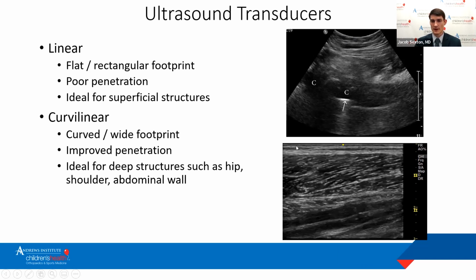While the bottom one has this nice flat top transducer probe image, and you can see it propagating directly down almost in a square, which lets you know we're looking at more of a linear probe footprint.